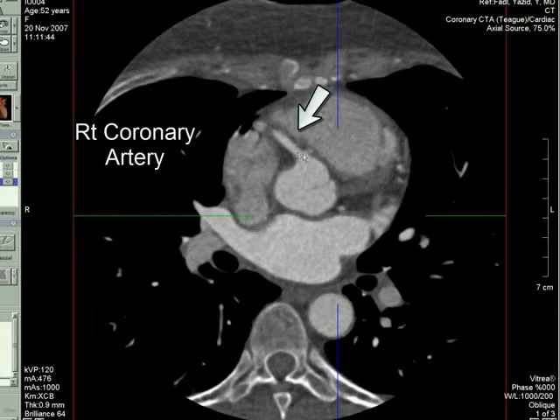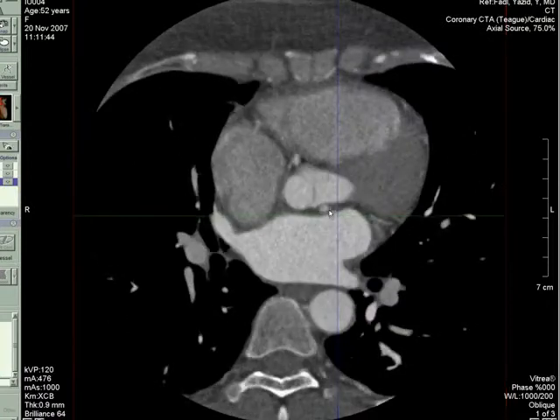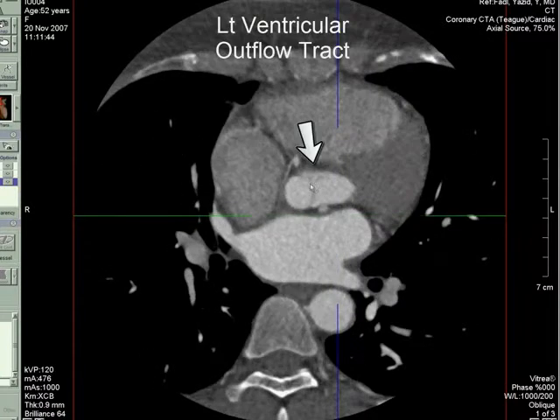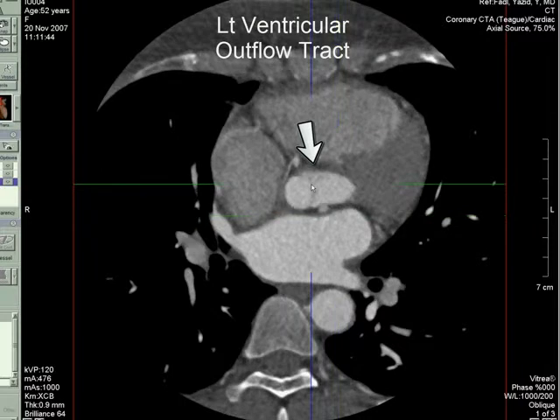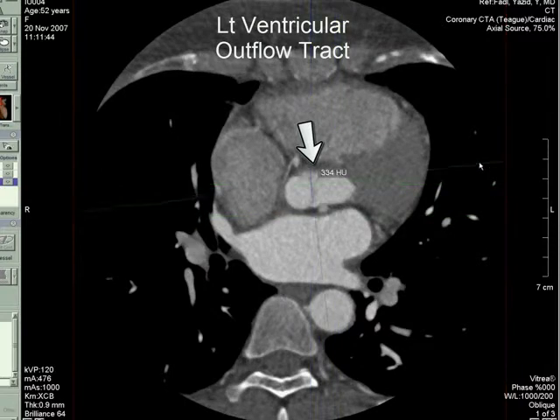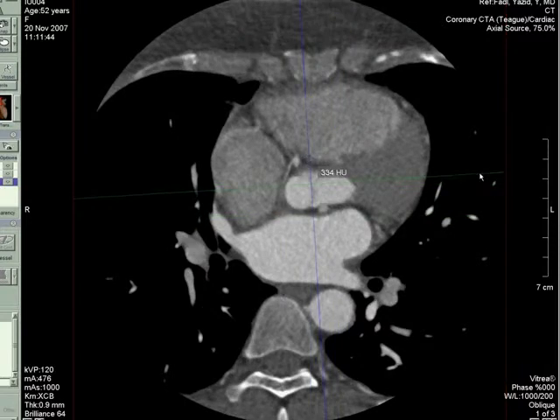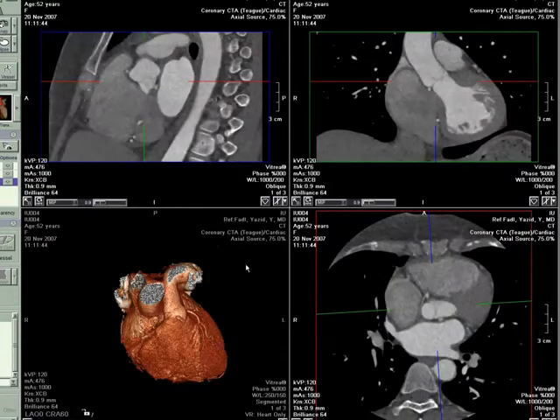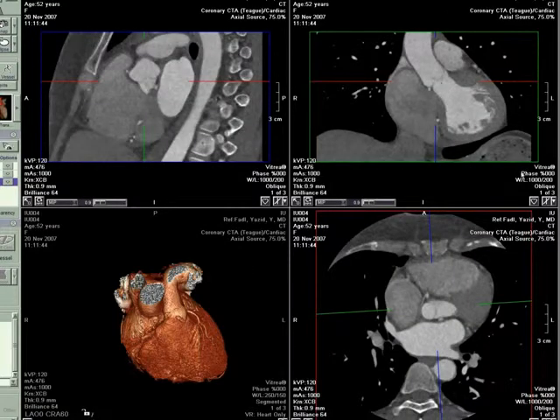So let's take a better look at that. Here we have the left ventricular outflow tract, so I'm going to center around here. I'm going to make a plane that's basically along the angle of the left ventricular outflow tract — that's this corresponding coronal view, if you will.